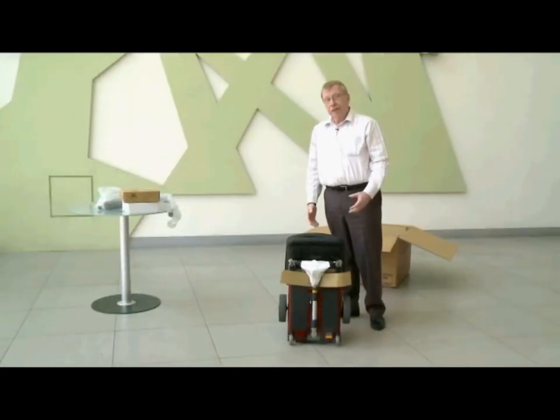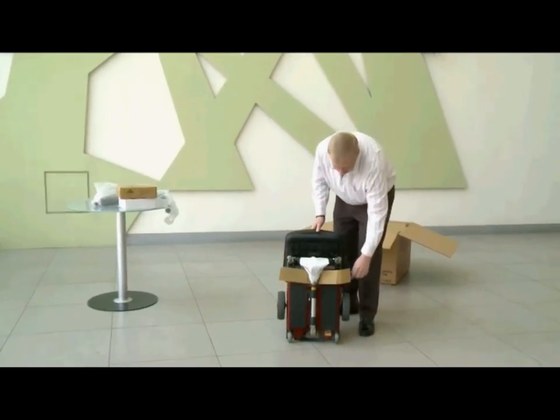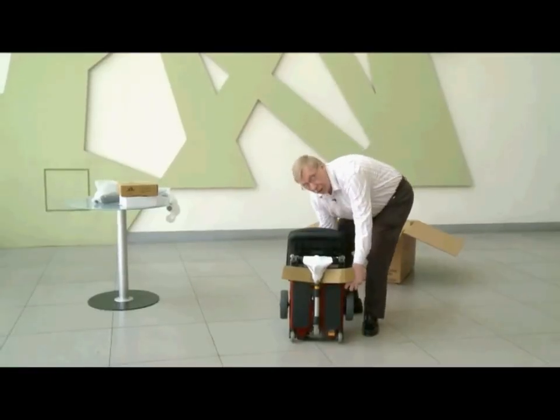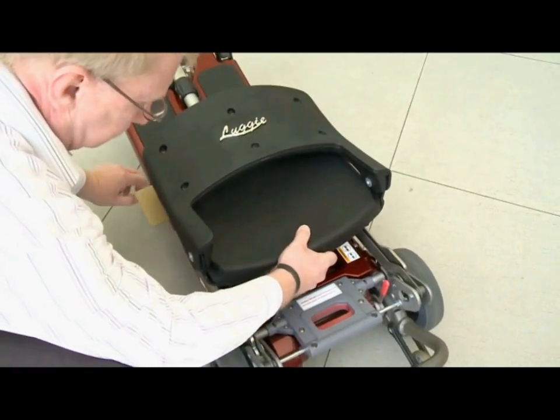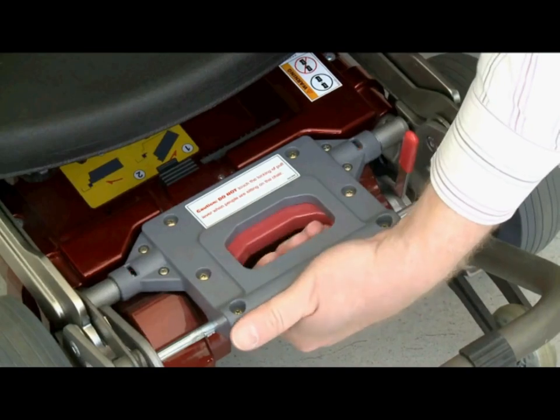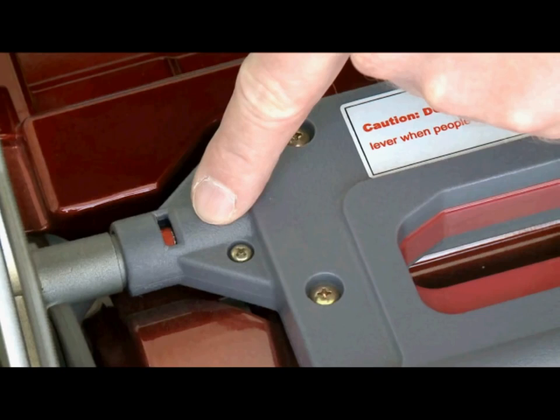Now that you've taken the scooter out of the box, you want to unfold it. And to do that is quite simple. There's a lock ring here that you pull and hold the back of the seat like so and just pull it. You want to raise the seat up by holding the handle and lifting the seat up until it locks.